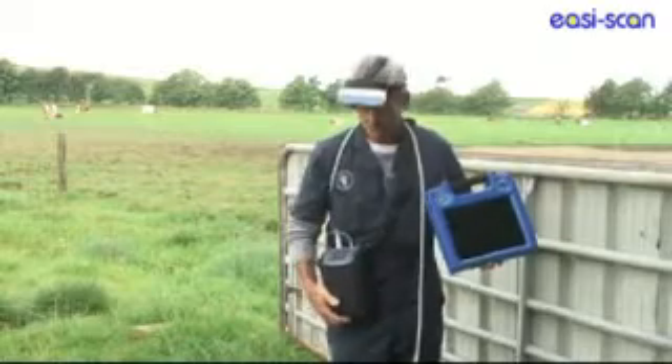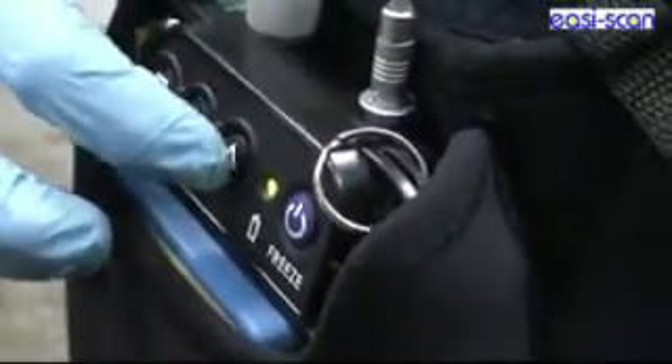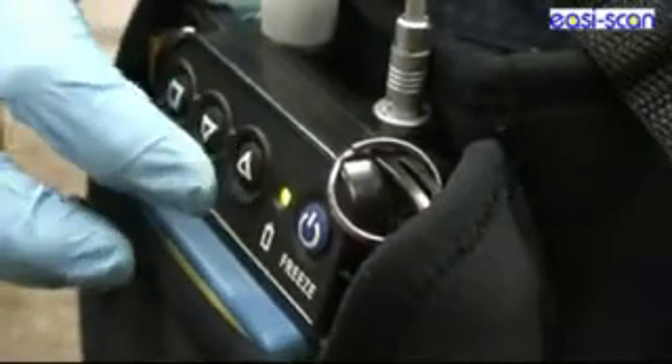Other accessories with the EC Scan are the waist pack that holds the units, or a backpack if you prefer to use the unit in a backpack.